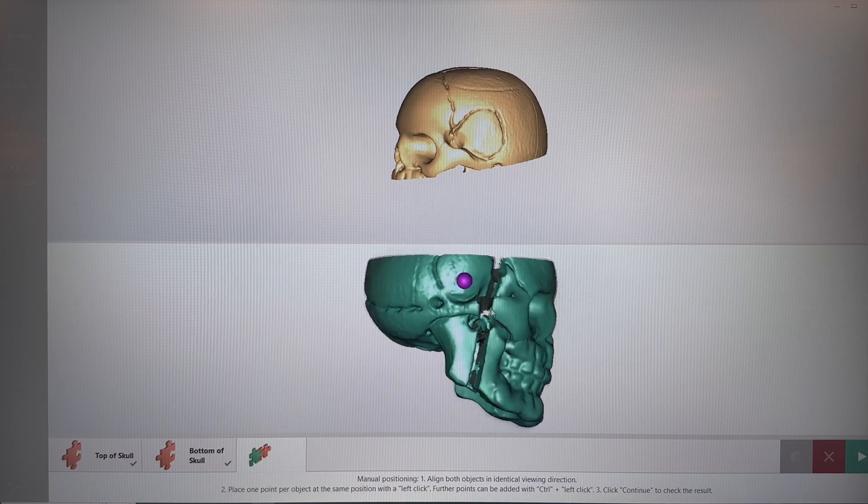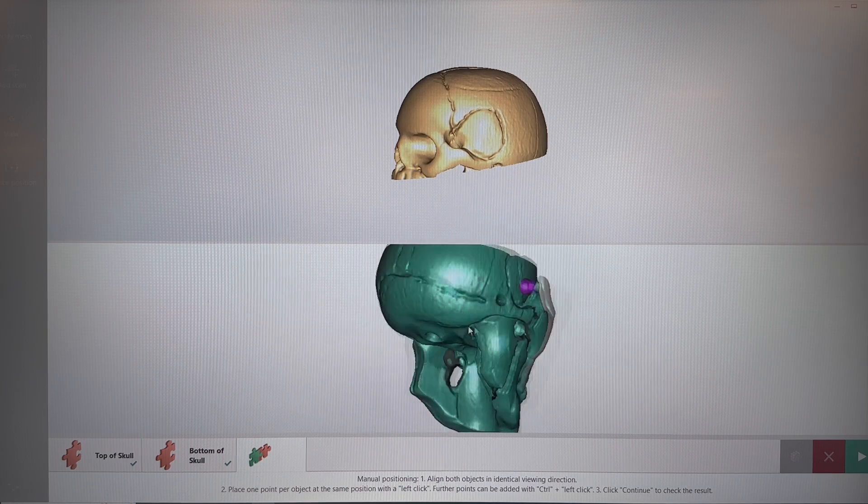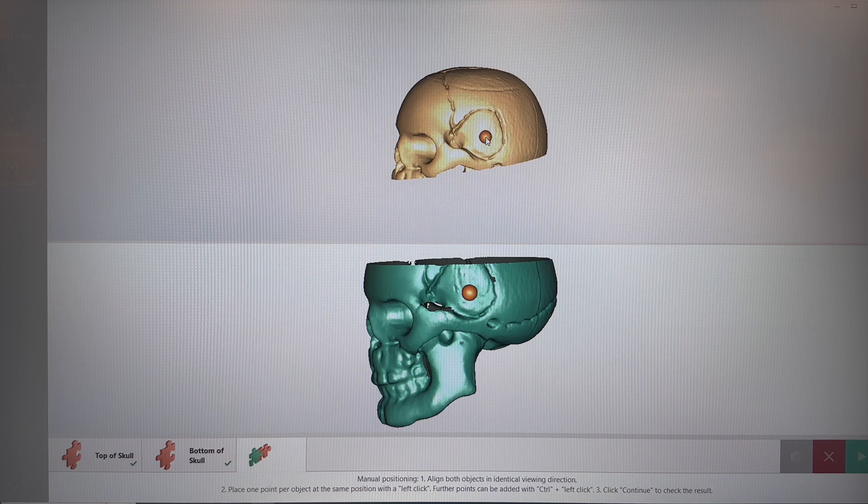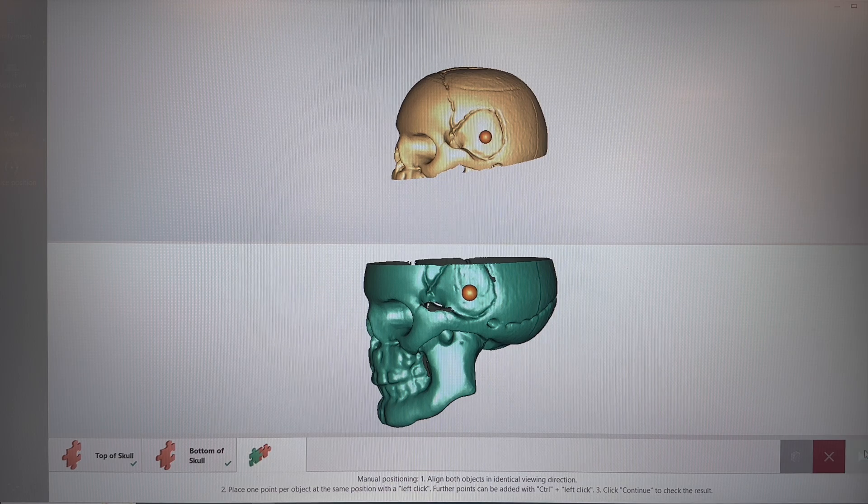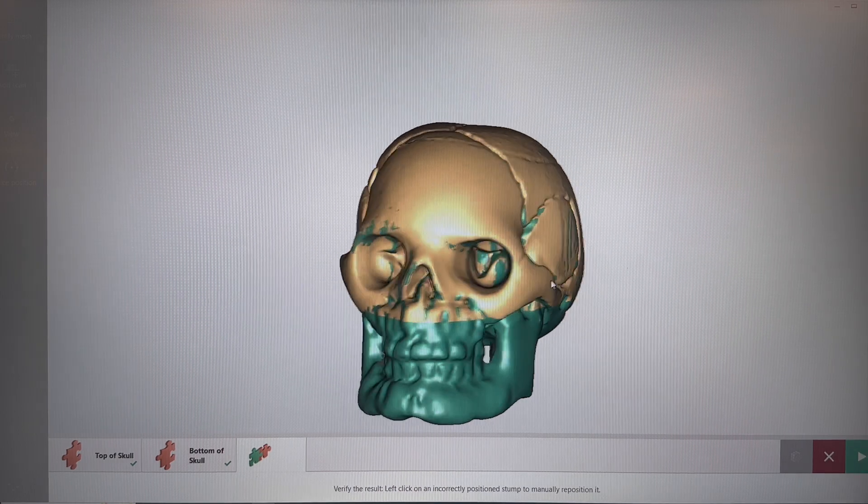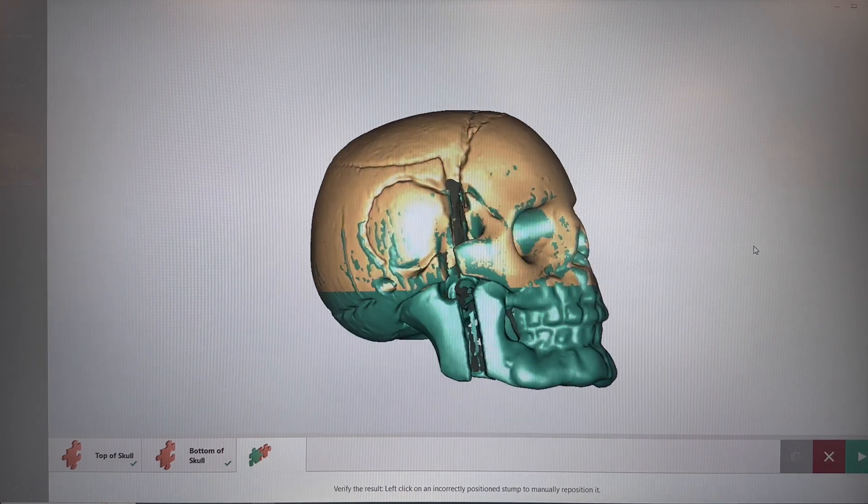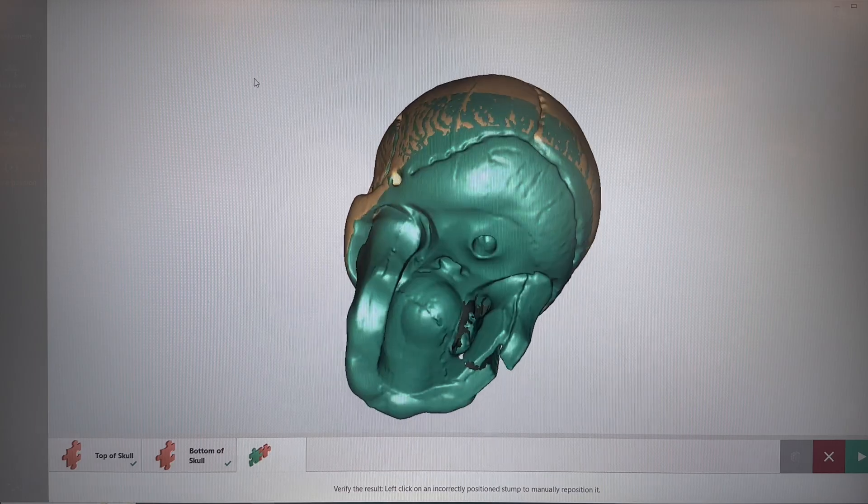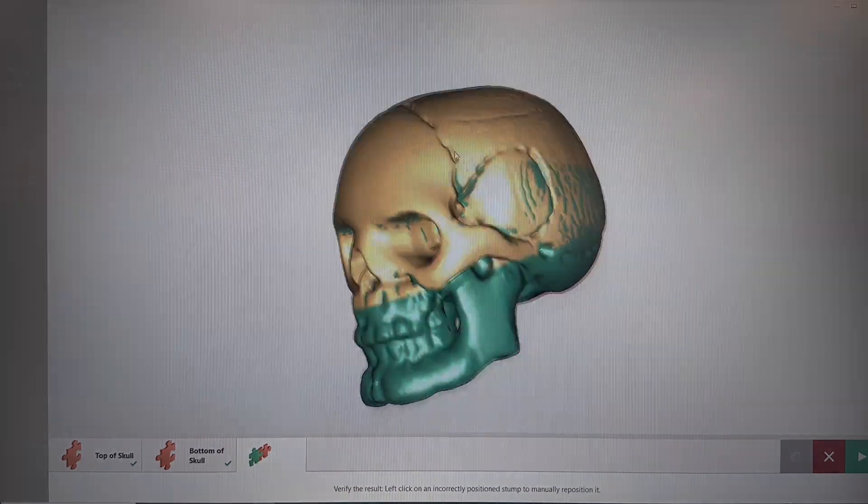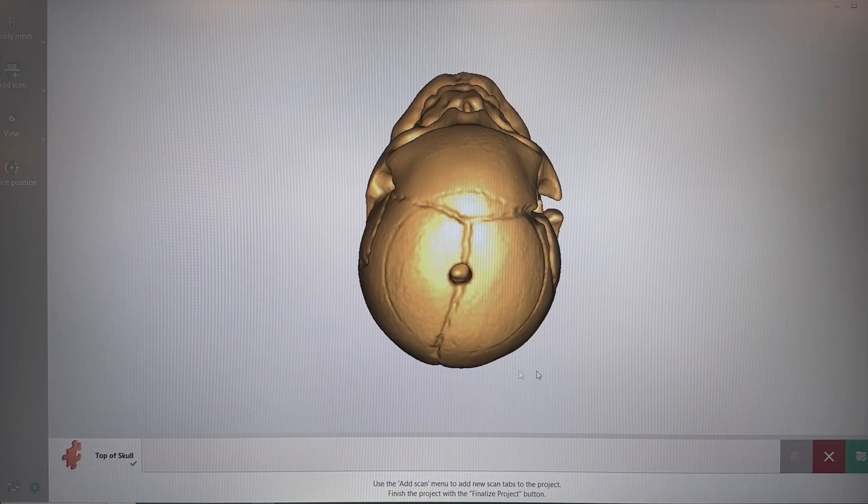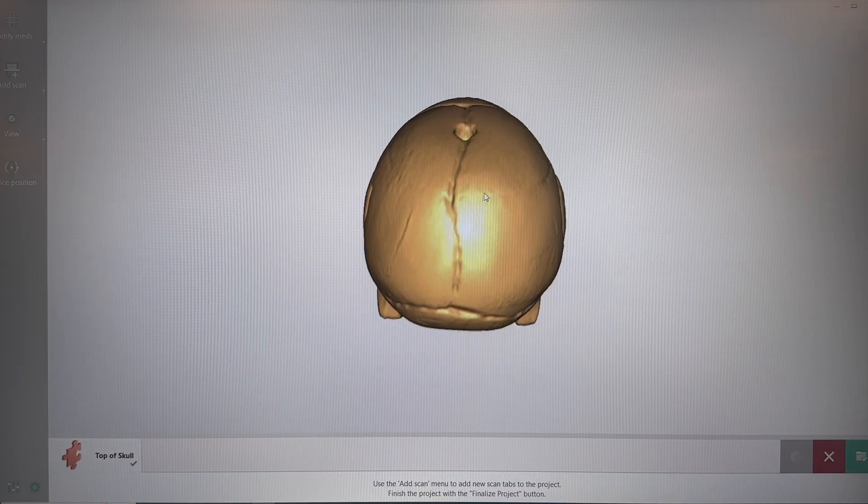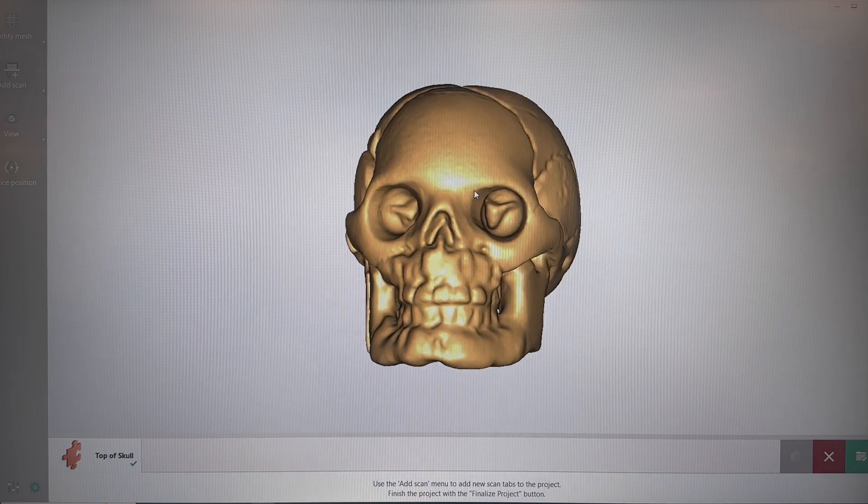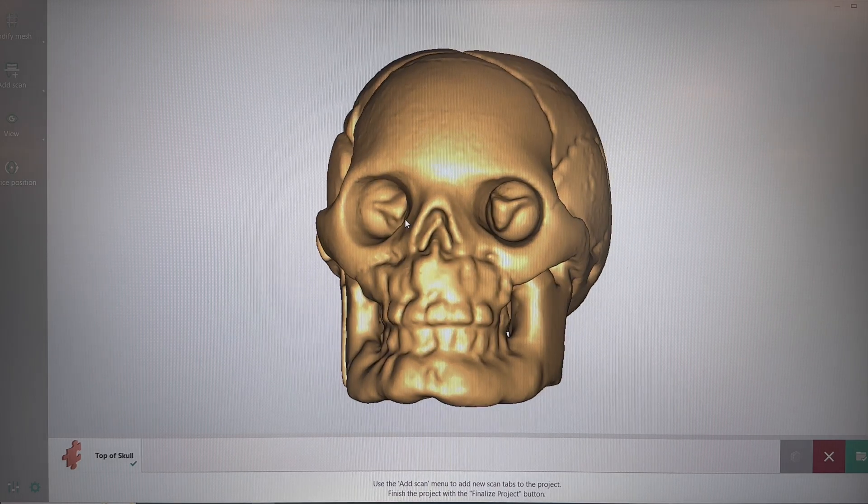We're going to do the same thing on the opposite side. For this one, you're going to hold Control and click the dot. Click Next, and you'll see the scan has meshed together. We're going to click Next one more time, and there you go. Your scan is all done.